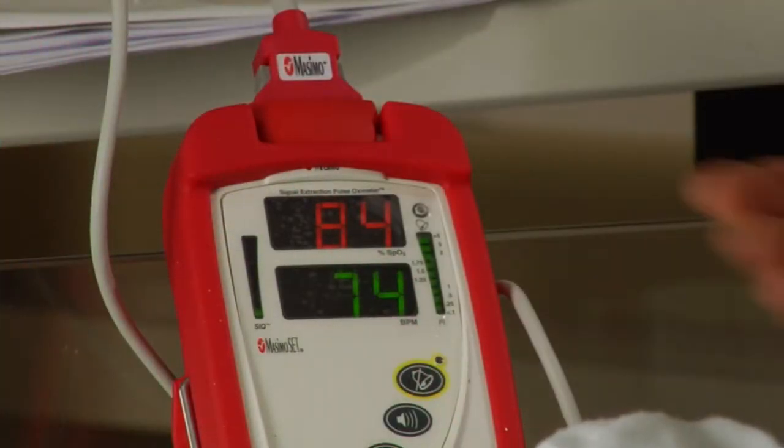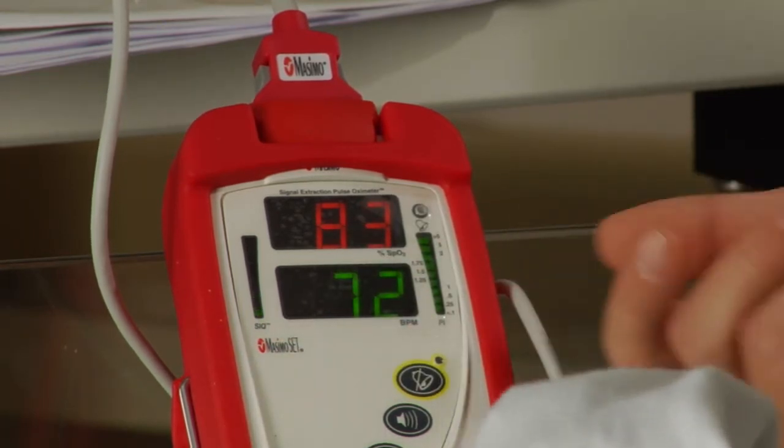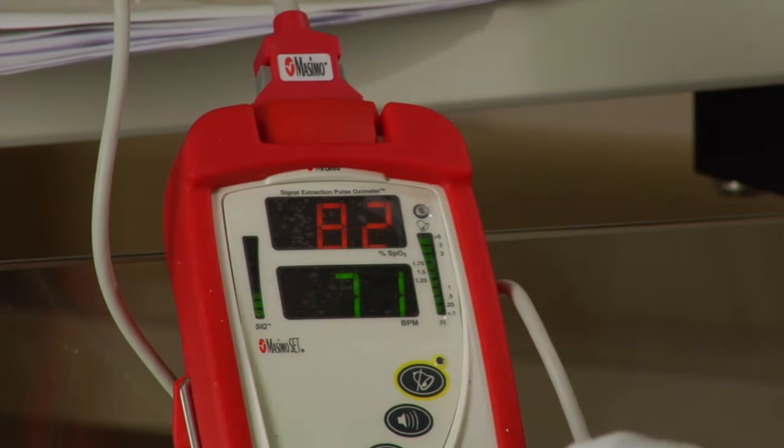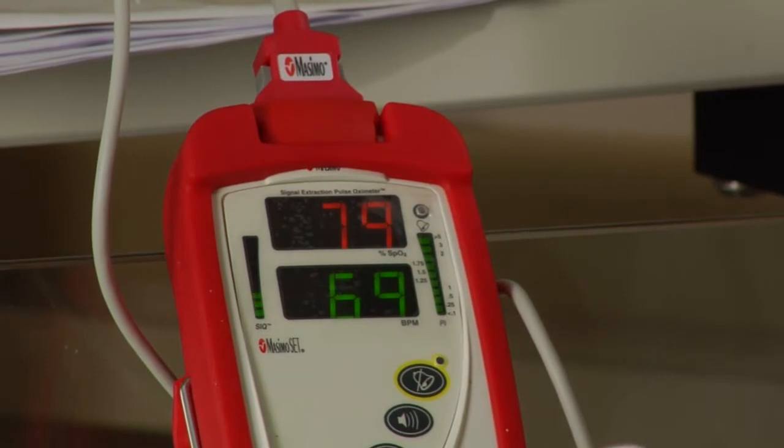So as we can see, right now we're getting a reading of 84%, but we're not getting a good signal IQ. The perfusion index looks adequate. So in this case, I would just wait and wait for that pulse oximetry probe to start picking up the baby's heart rate.